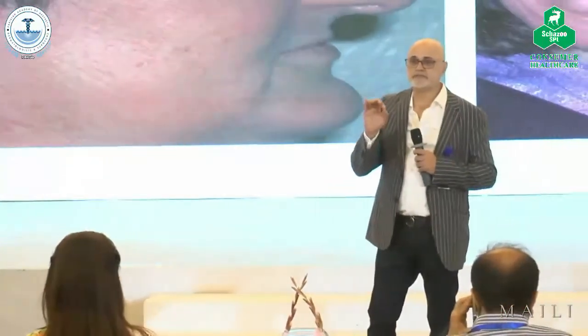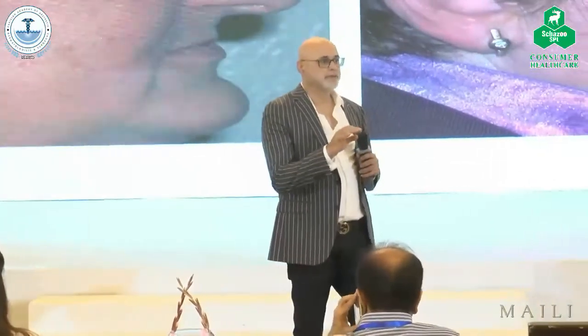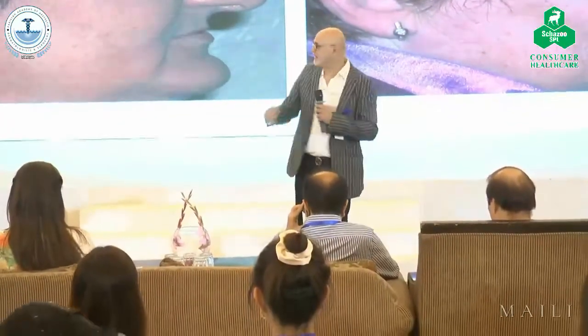Remember that hyaluronidase is just like adrenaline in an emergency. It is not only good for vascular accidents, but most of the time we have to correct overdone fillers.